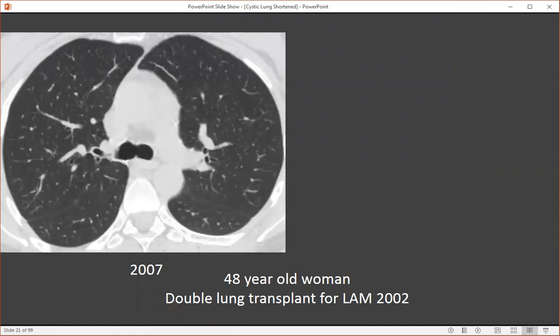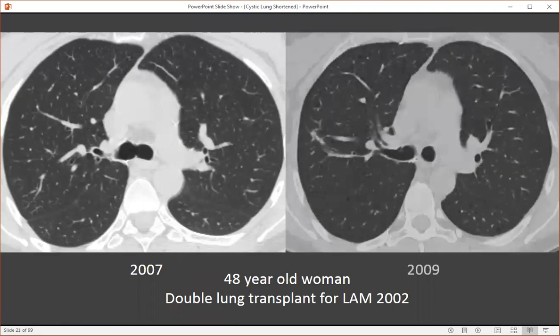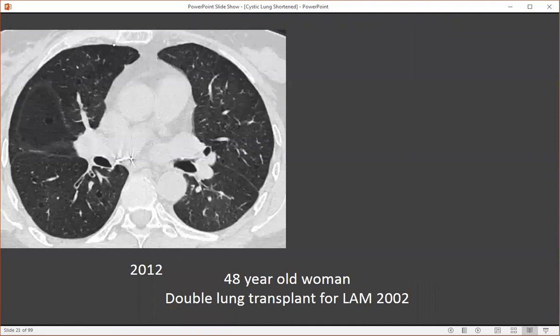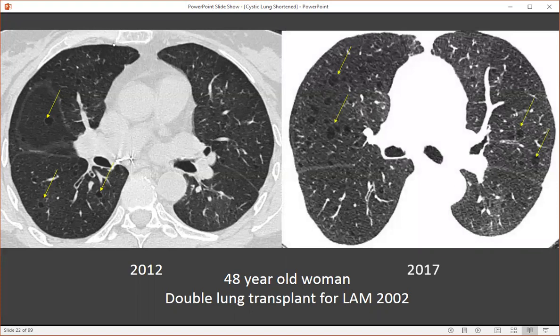Here's a 48-year-old female with a double lung transplant for LAM in 2002. In 2007, five years afterwards, her CT appeared relatively normal. However, two years after that, she started developing a couple small cysts in the lung bilaterally, resembling her initial case of lymphangiomyomatosis. Three years after that in 2012, the cysts had increased in size and number bilaterally, but again were diffusely distributed, uniform in shape and size with normal intervening lung parenchyma. In 2017, the cysts continued increasing in size and number — this is an example of recurrent lymphangiomyomatosis, which can occur after the patient has received a double lung transplant.